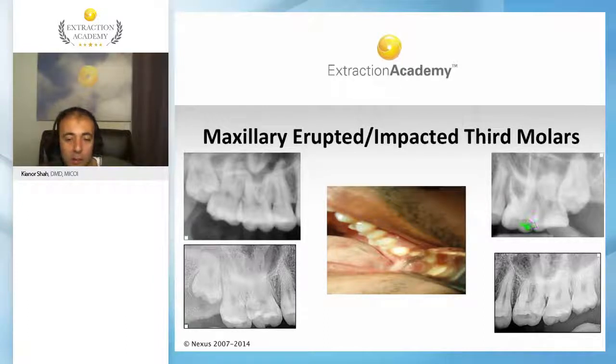So you'll see that in these surgeries I press the Minnesota against the distal area of where I suspect the tooth to be, and I keep it there. It gives me the visibility of my surgical area, and also it prevents the tooth from going into no man's land, and it allows the tooth to come down when I do my elevation motion and pull out, protecting the tooth, preferably with something in the back of the throat, when we are doing this motion or in a controlled fashion.